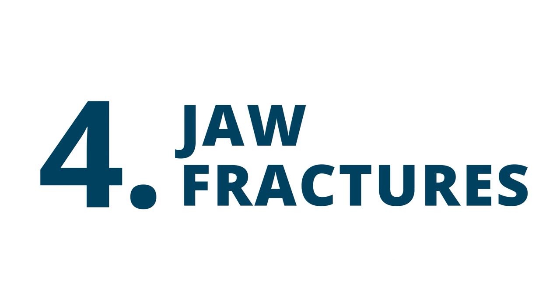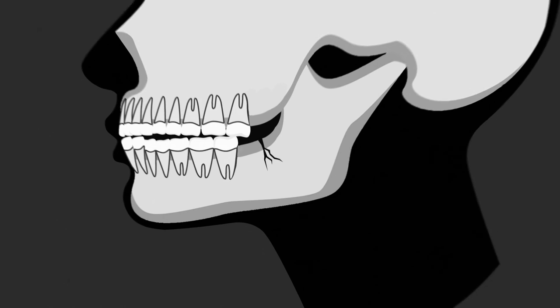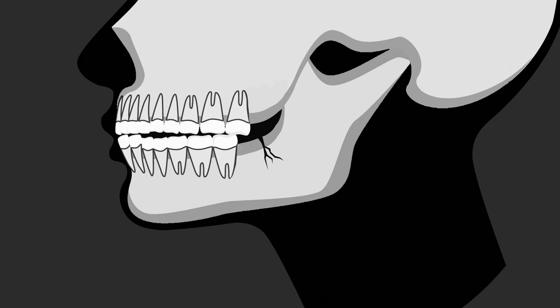4. Jaw fractures. Dental x-rays detect fractures in the jawbone that may result from trauma or injury to the face. Common symptoms of a jaw fracture, like swelling or a change in your bite, may not be noticed right away, so fractures are best diagnosed with a dental x-ray.